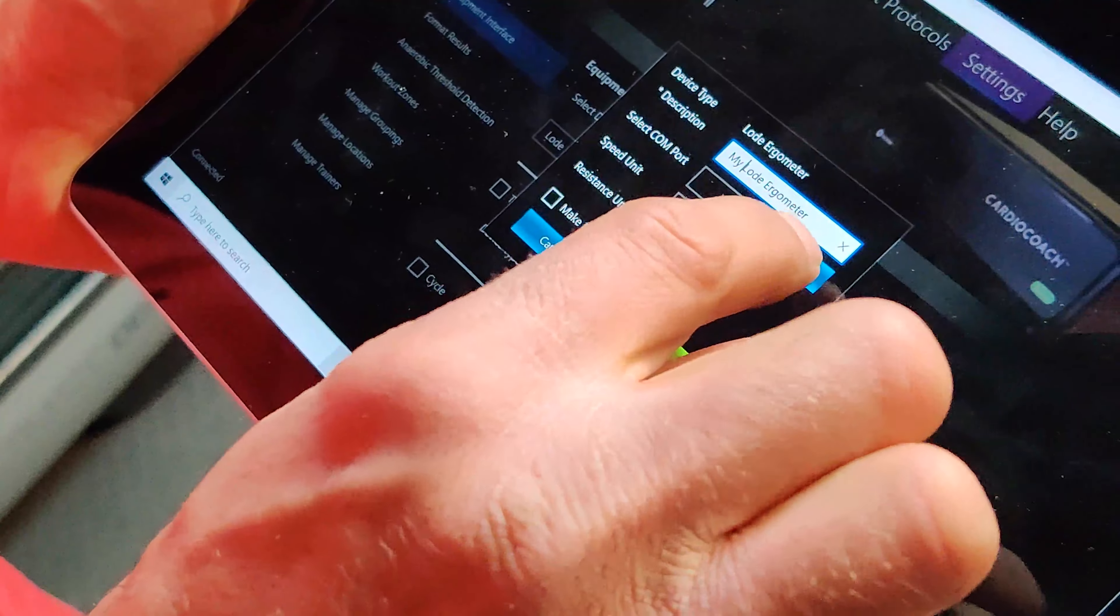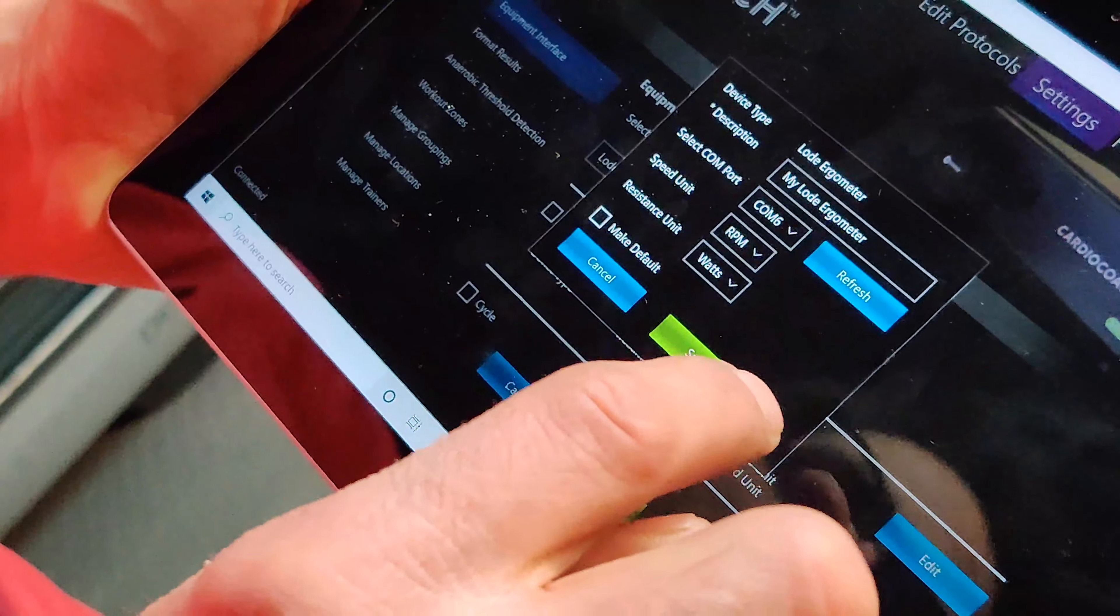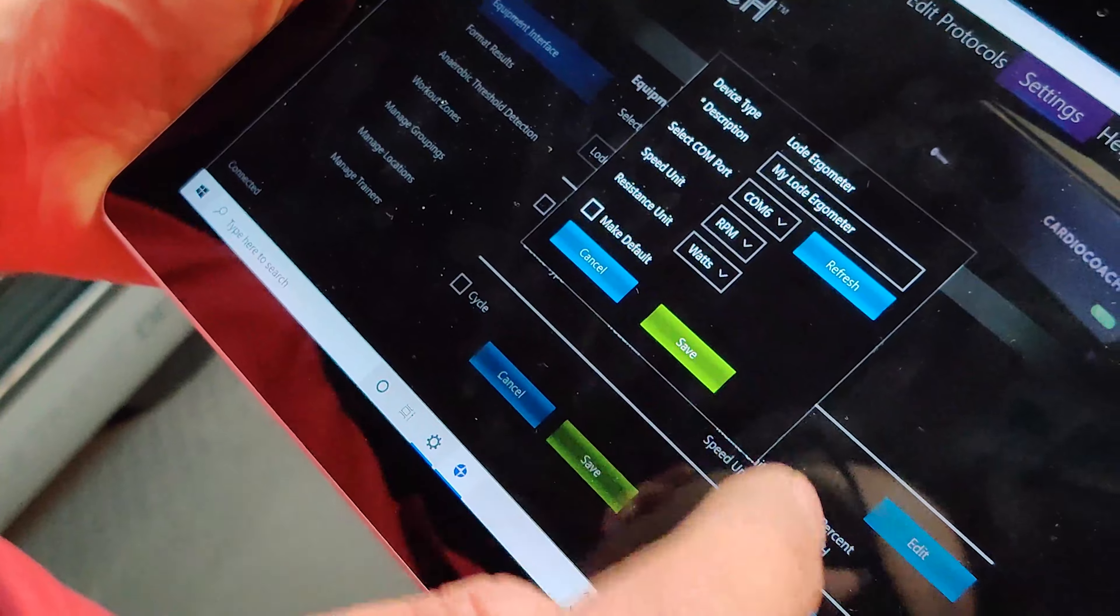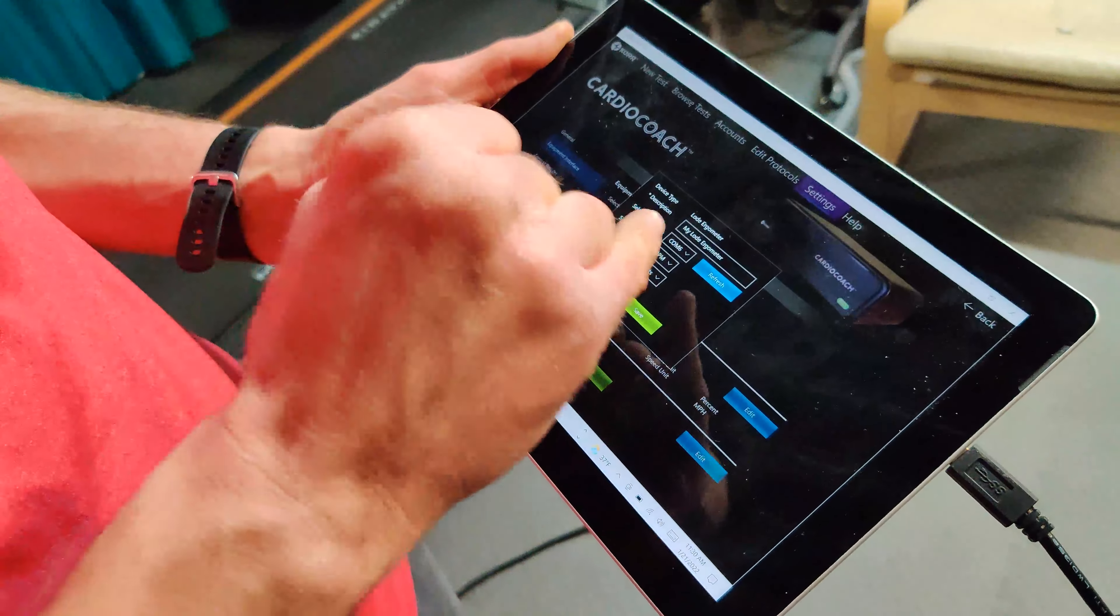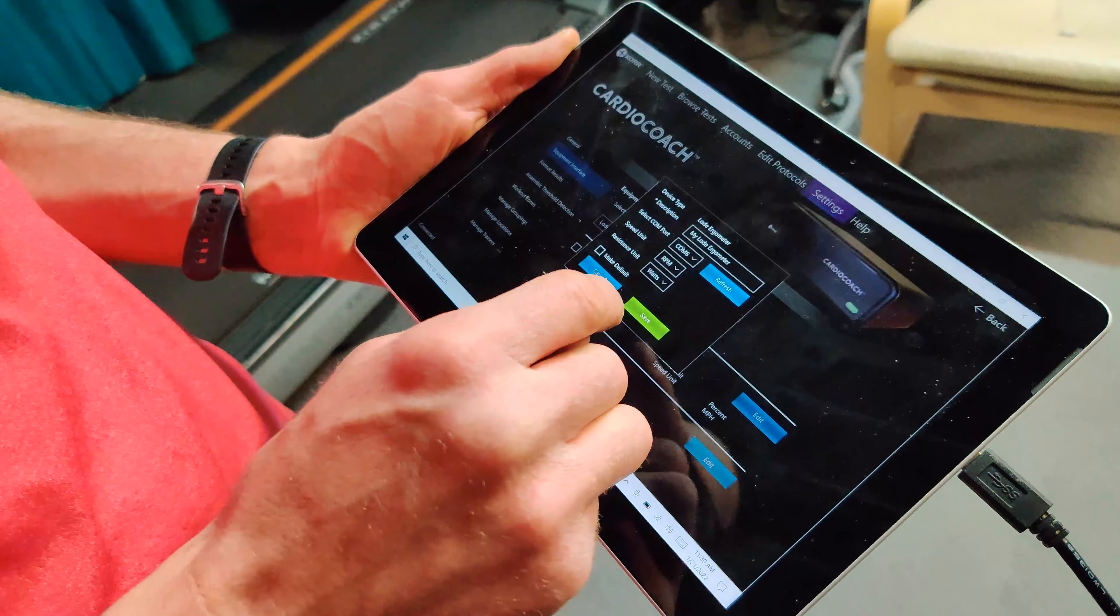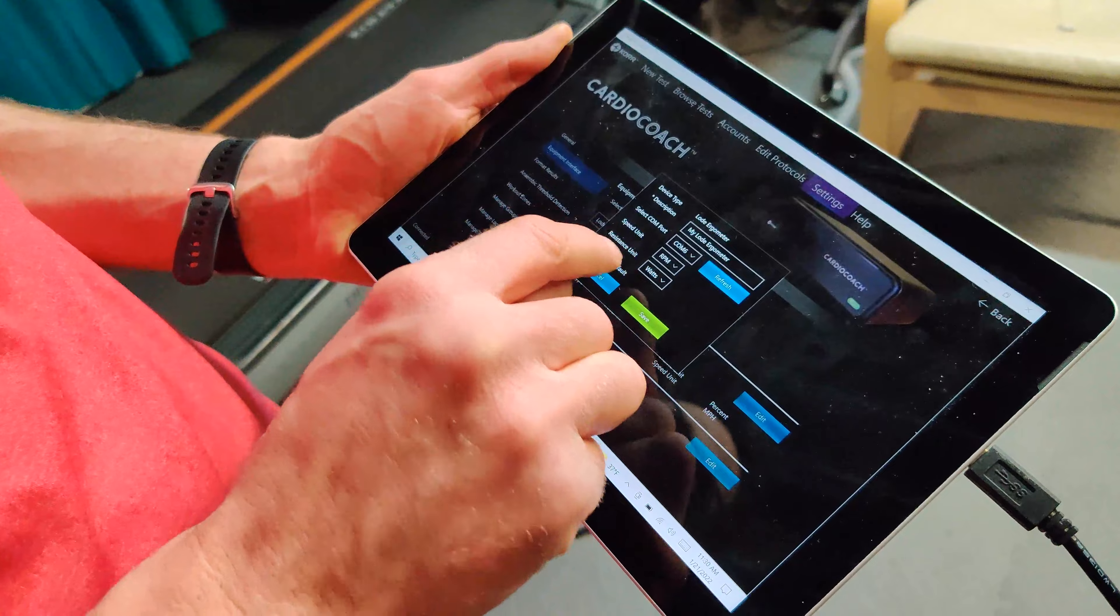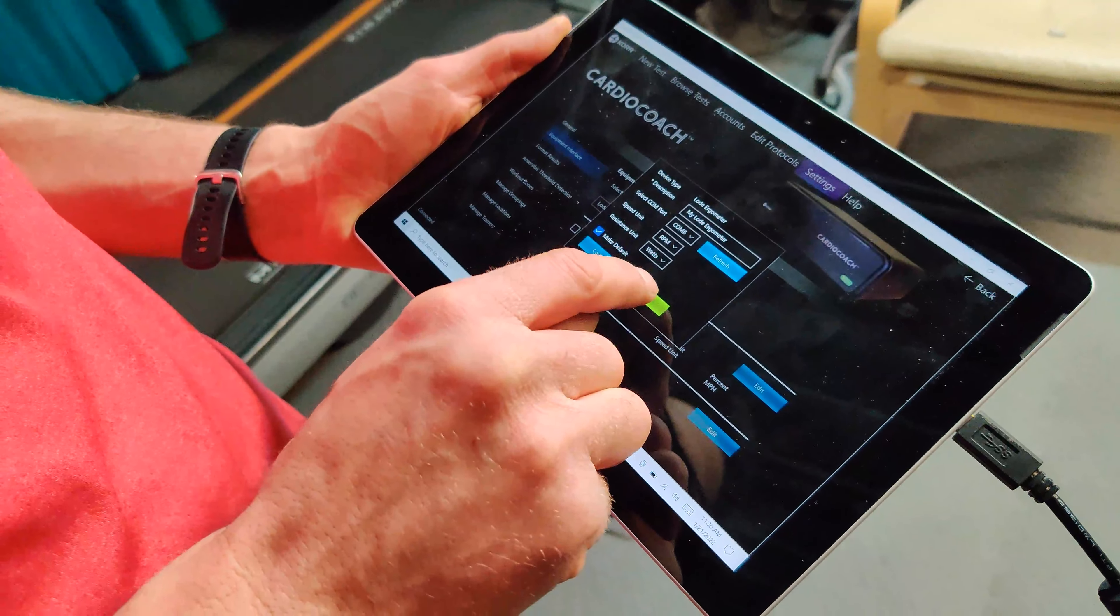Make sure the correct port is selected. If you don't see anything there, click Refresh. Select the units you would like to use, then click Make Default, then click Save.